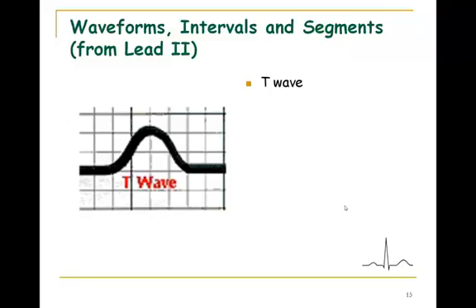It seems very complicated, but just remember that the repolarization waveform you see, the T wave, is usually upright. Things that really severely delay repolarization or even depolarization can leave you with inverted T waves.